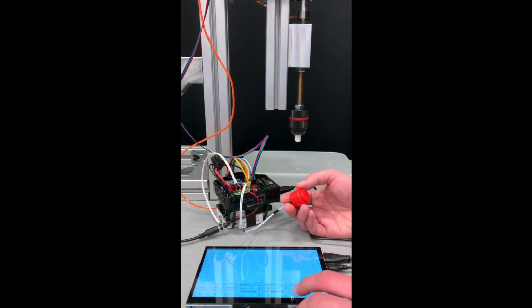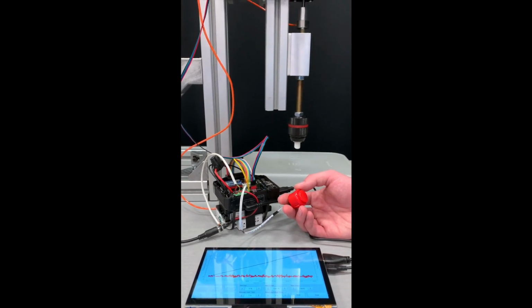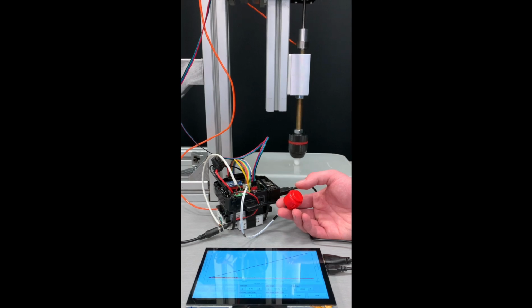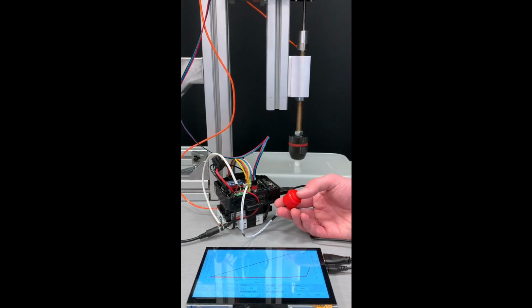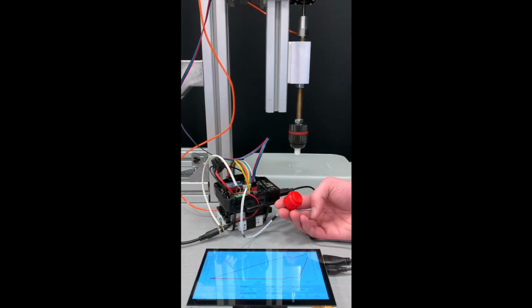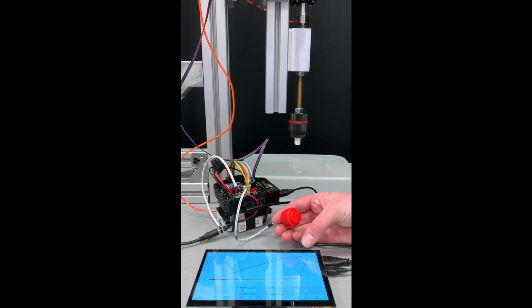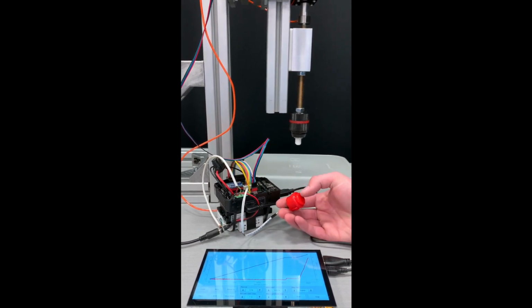So let's begin a measurement. The indenter head moves down, and once the load is applied, let's say that the patient starts experiencing some discomfort. All they have to do is press their button, and the indenter head immediately begins retracting. At this point, the graph also stops updating as we've cancelled our measurement.